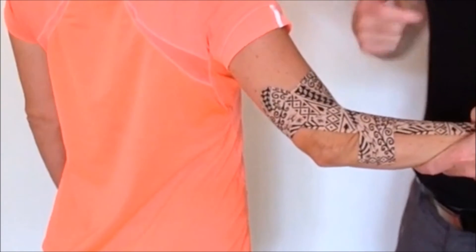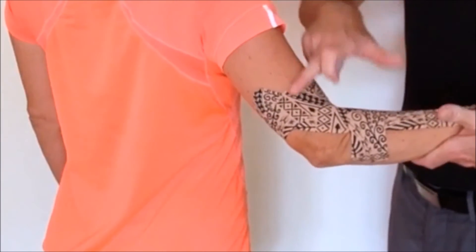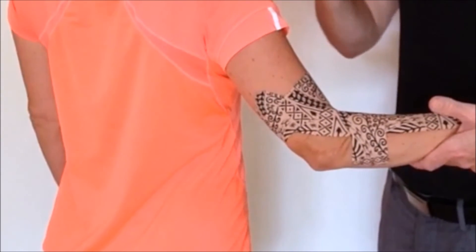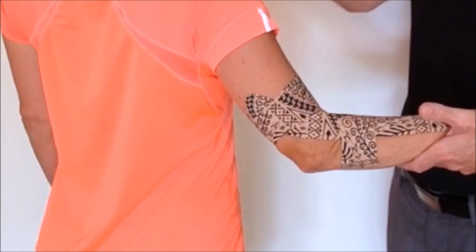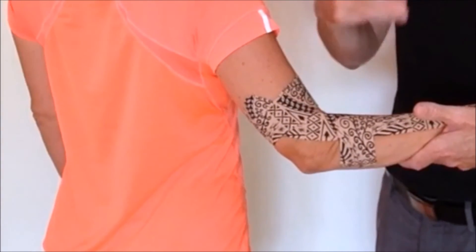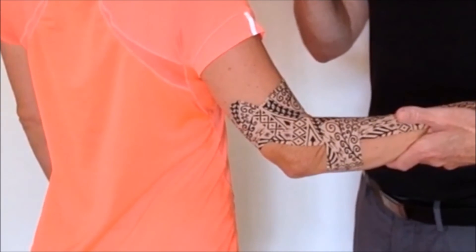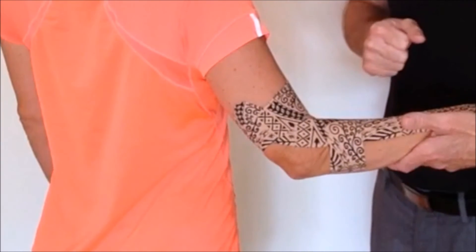That can be useful for your tendinopathies. We know that they're brought on most rapidly from a combination of tensile and compressive loading. So we can do some work to reduce that overuse or tensile load, and we can box up around some of them where they're superficial to reduce some of that extrinsic compressive load. But also our neural tissue — we know that when it's sensitized, it doesn't like stretch. It also becomes allodynic, meaning it doesn't like pressure. So for some nerves where they're relatively superficial, we may be able to box up around all that soft tissue to reduce some of that extrinsic tissue pressure that may continue to sensitize that nerve.